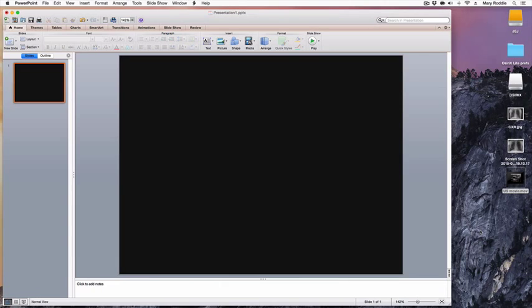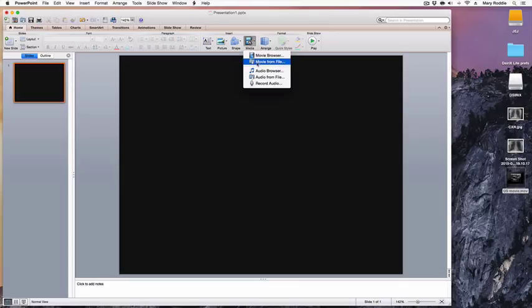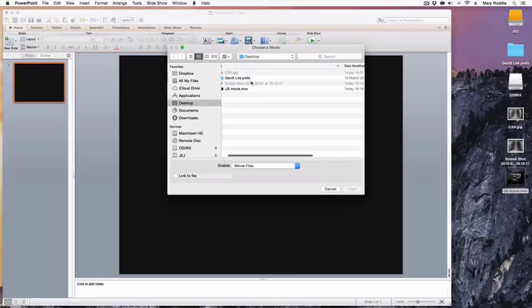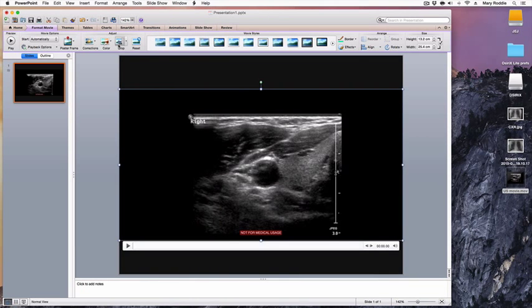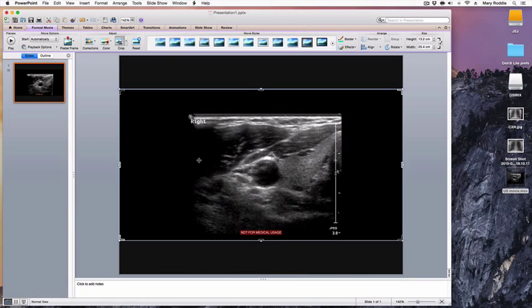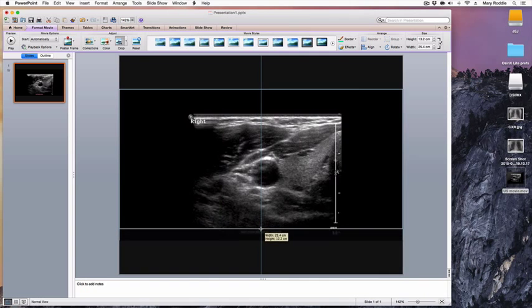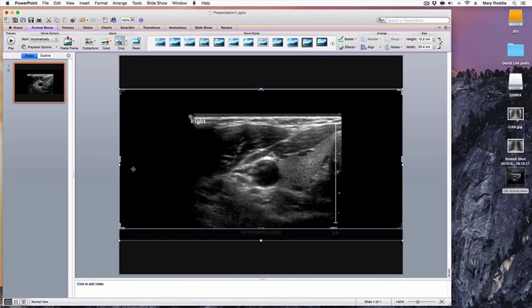I have now opened a PowerPoint presentation and I'm going to import that movie into the presentation by selecting a movie from file and selecting the ultrasound movie from the desktop. I now have an opportunity to crop the movie clip, and by moving the bottom bar up slightly I can exclude the 'Not For Medical Usage' logo.